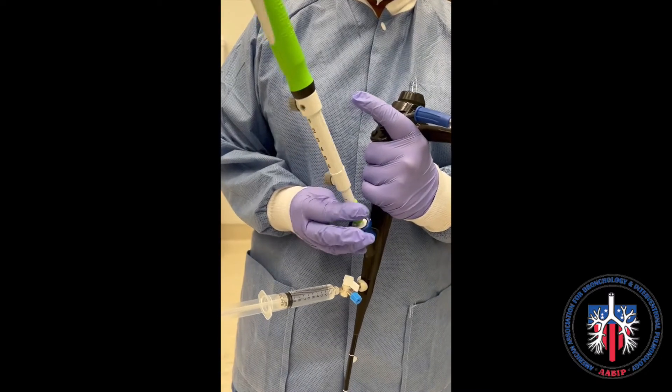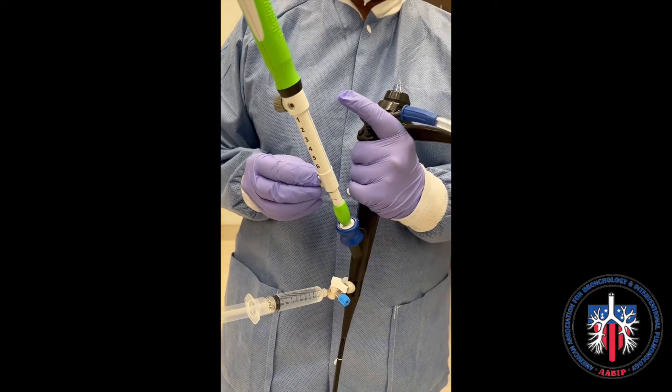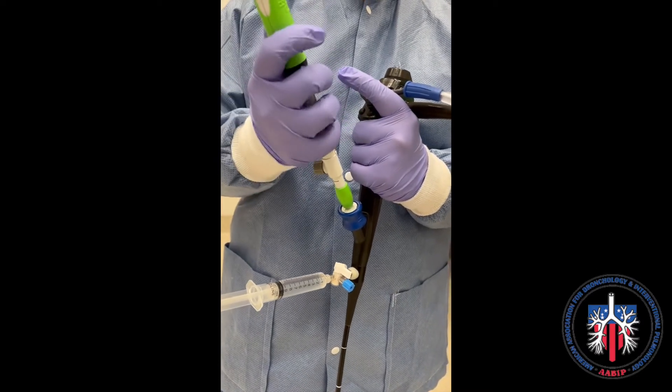The acquiring needle is secured into place by rotating it into the bronchoscopic adapter. Next, the sheath is advanced into place. The needle is 6 cm in length and can be adjusted to the desired length.